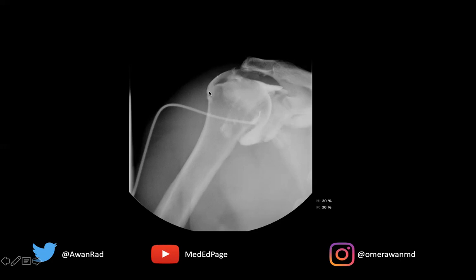Any contrast that goes beyond the greater tuberosity is not part of the joint capsule — this here is the greater tuberosity, and the joint capsule does not extend past it. So this fluid or contrast is in the subacromial subdeltoid bursa.